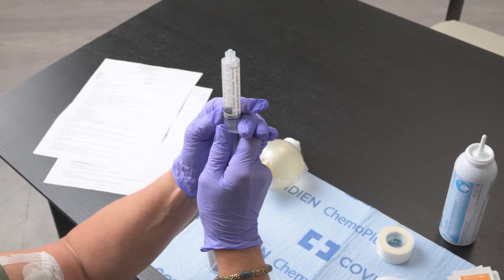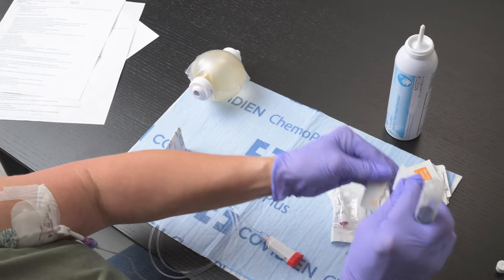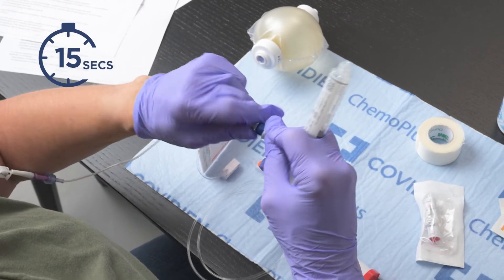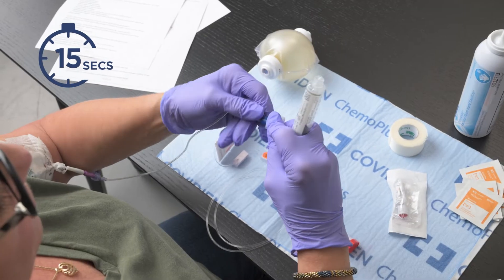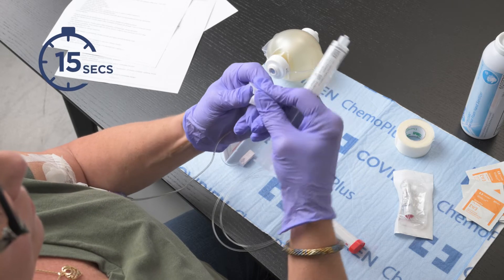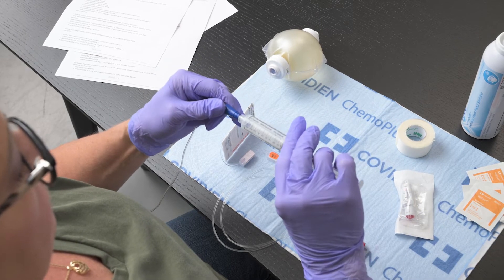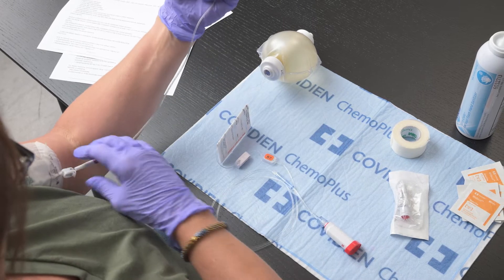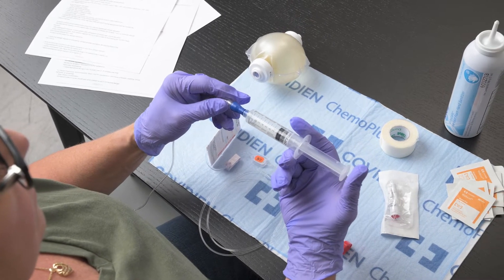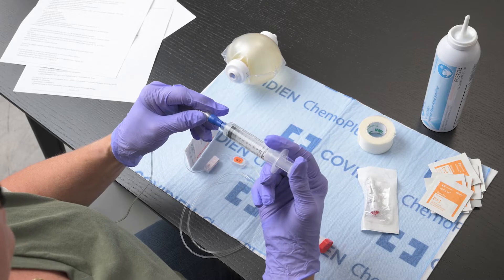Remove any air from the saline syringe, taking care not to contaminate the tip. Using an alcohol wipe, vigorously scrub the hub of the blue end cap on your IV line for 15 seconds and let it air dry without touching anything. Twist the syringe onto the blue end cap at the end of your IV line. If you have a clamp on your IV line, unclamp it now. Flush the line using a push-pause method. Twist off the syringe when complete.